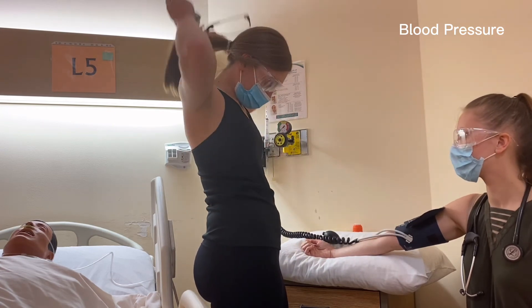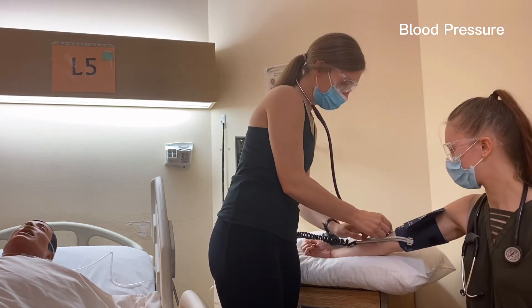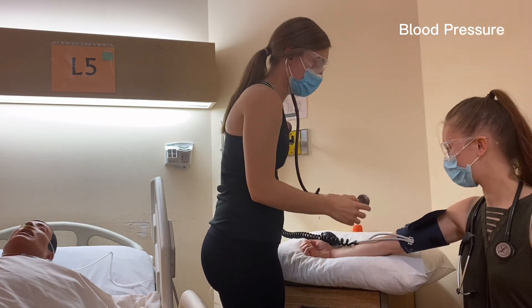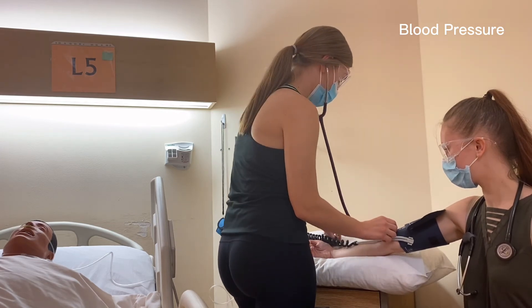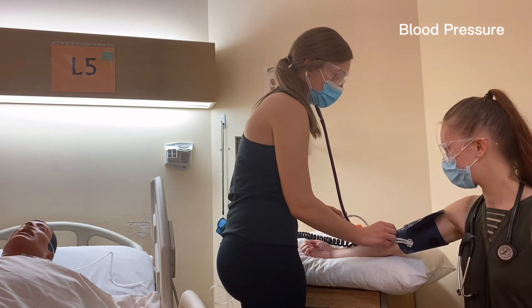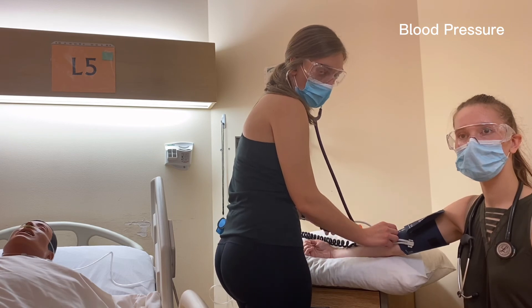To take the blood pressure, we auscultate at the brachial artery. We put our stethoscope where we felt the pulse, over the brachial artery. We keep the bulb in a locked position, and when we inflate, we'll go about 20 to 30 above the 102. When we slowly deflate, we go at 2 millimeters of mercury per second. We take note of when we hear the first beat — that'll be the systolic — and then when the sound goes away, that'll be the diastolic.